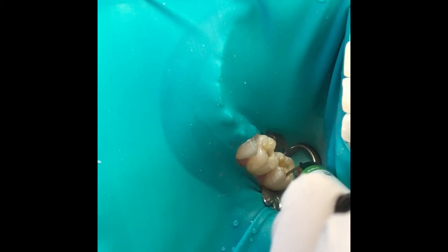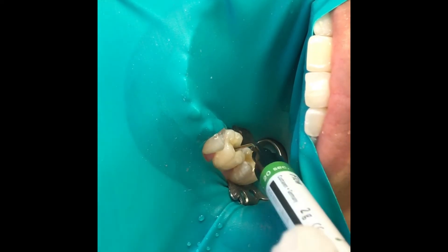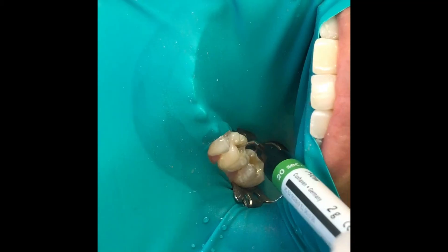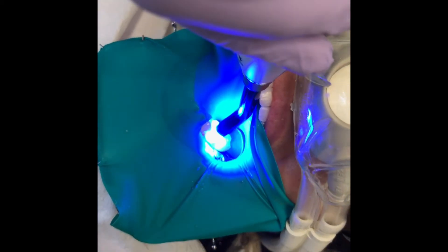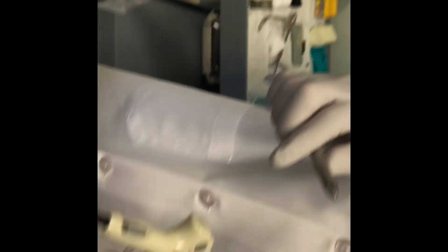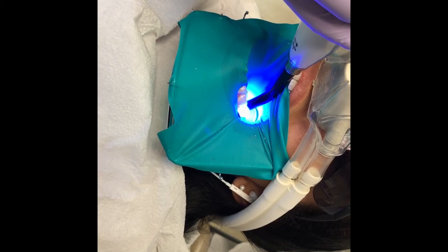You can see the yellow dentin that is exposed once the amalgam is removed. I find that the more the natural tooth-colored replacement materials match the consistency of natural tooth structure, the better it feels when you chew on them. These teeth were designed a certain way for a certain reason — if you've got a hard material that's too hard, it performs differently. Next we have a more dense material that's going to be used to replace the white enamel. When it cures it's quite hard and it performs more like enamel.